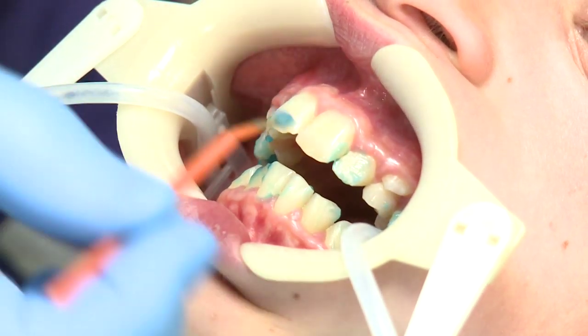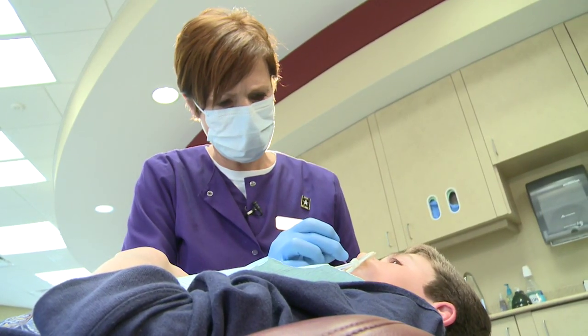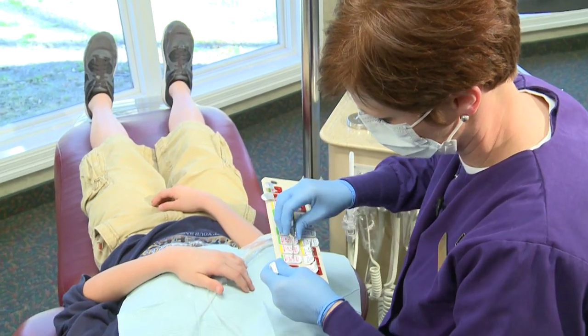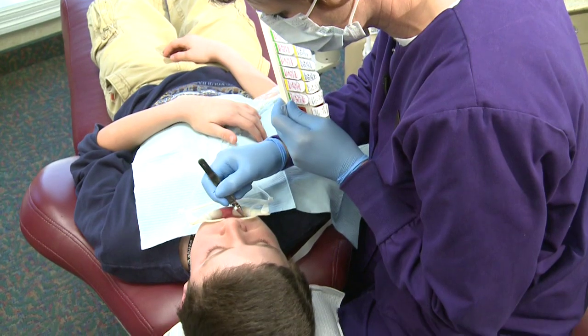We begin by applying a special cleaning solution, which is then rinsed away. The teeth are dried and a primer is applied to each tooth. With the primer applied, we are ready to place the brackets using a light-sensitive glue.